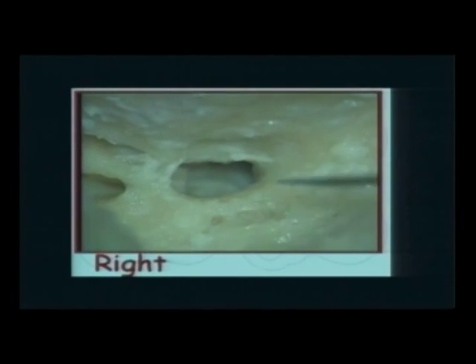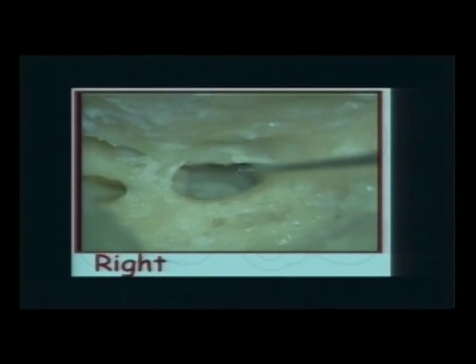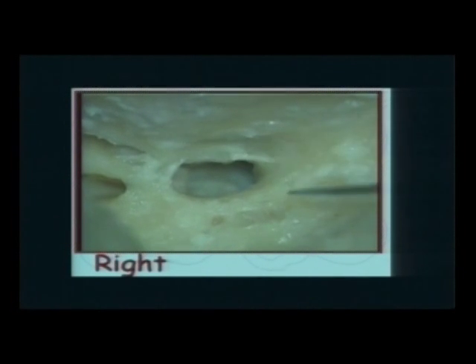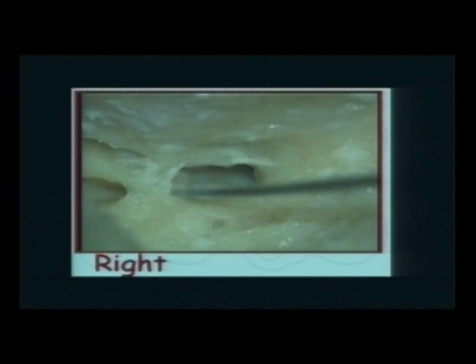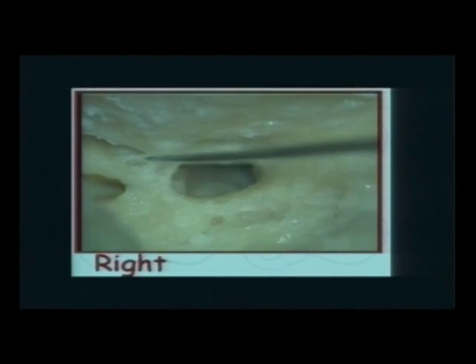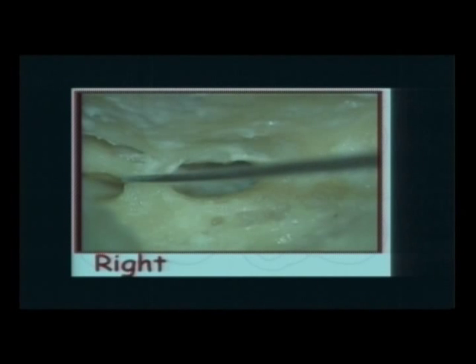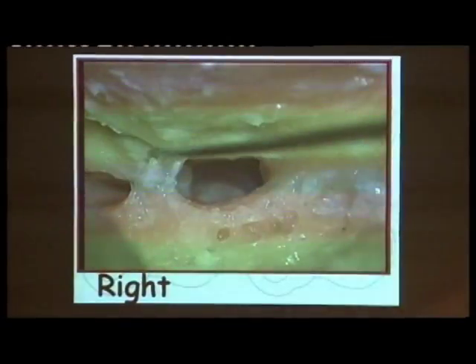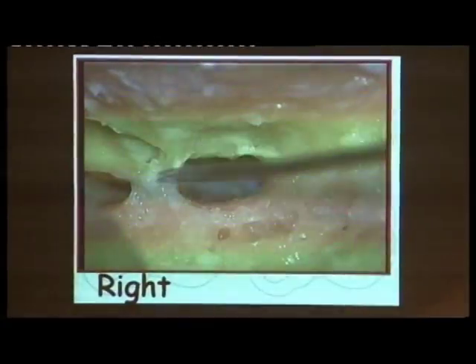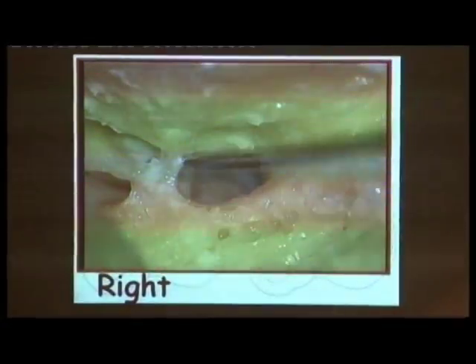I've removed the mucous membrane fold on the round window. So we have the chorda tympani, the facial nerve, and this is the posterior tympanotomy. And I like removing this piece of bone here. I like removing also some bone lateral here because it brings in light. Remember, in the facial recess, you have to bring in your instruments and you have to bring in light to see. So you shouldn't have anything shadowing.